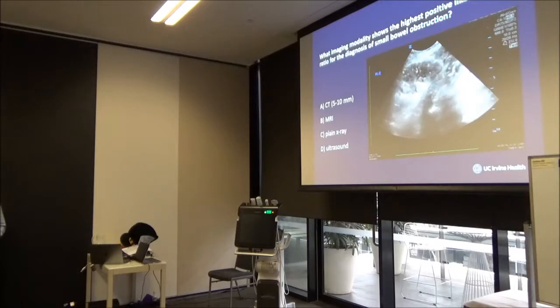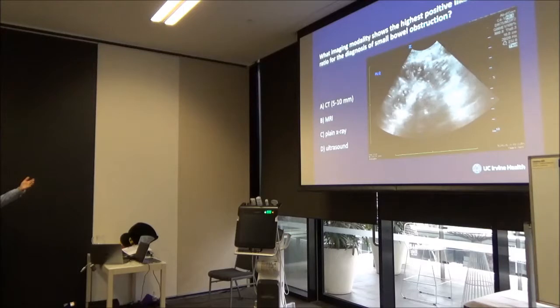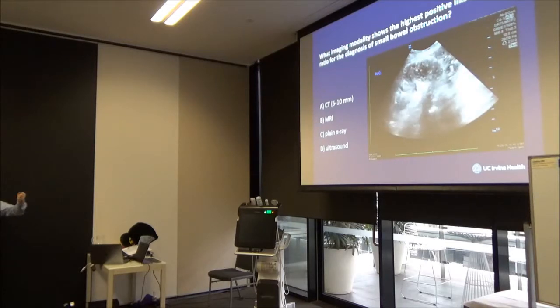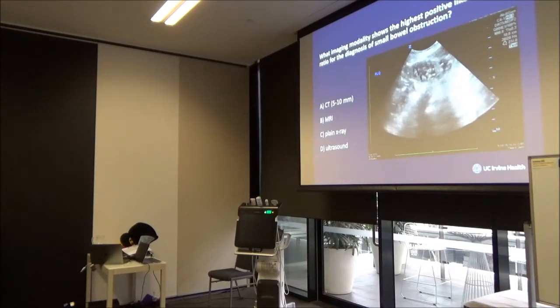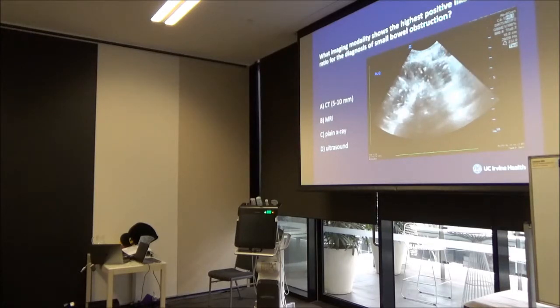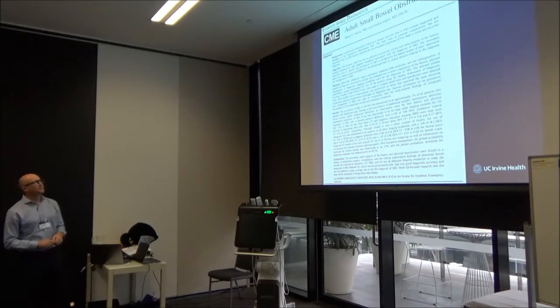As you can see here on this image of a small bowel obstruction, this hyperperistaltic bowel, and the stool and the fluid in there, the contents going to and fro, that to and fro nature, or you could say poo and fro if you want to be funny. So we say poo and fro in my emergency department. The patients, they're vomiting, they're kind of smiling when you say that. But this is what a small bowel obstruction looks like. Again, that fluid replaced the air, and it's so easy to see. I'm going to show you why ultrasound, hopefully, is the test of choice, in my opinion.